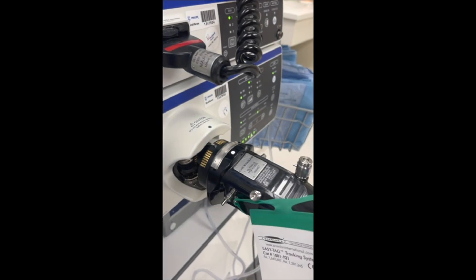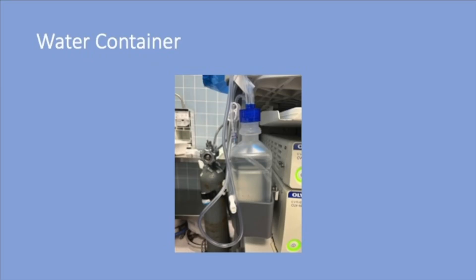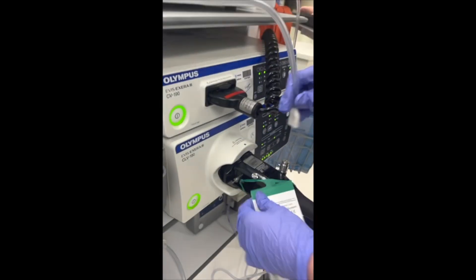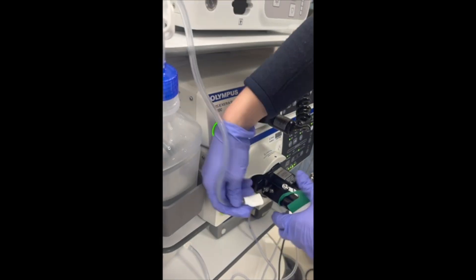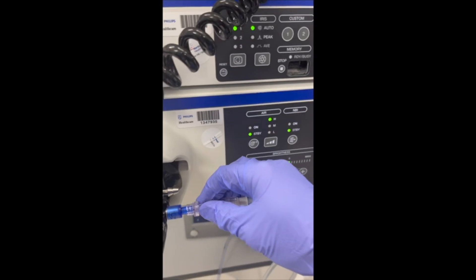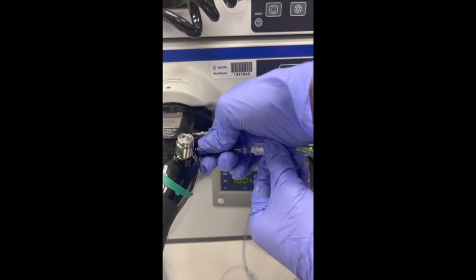First, plug the scope into the central piece of the tower. Then twist the two-piece cap onto the water bottle. The white end of the tube connects to the scope.